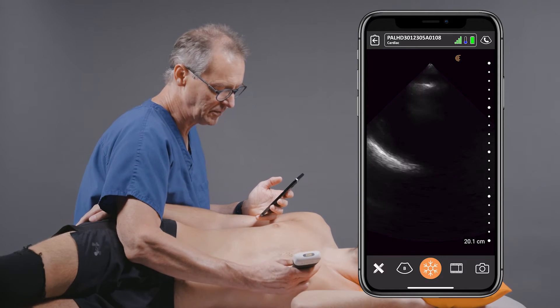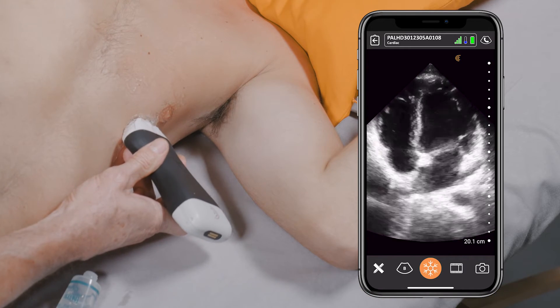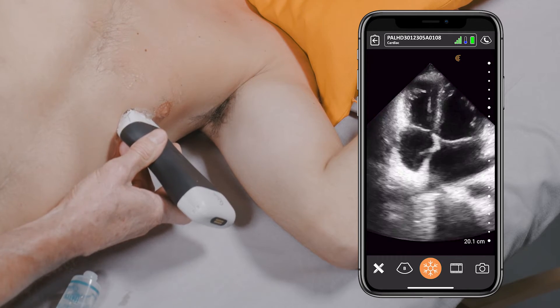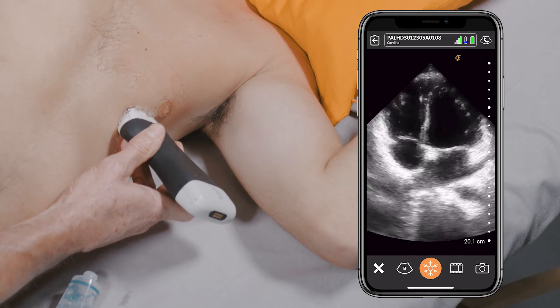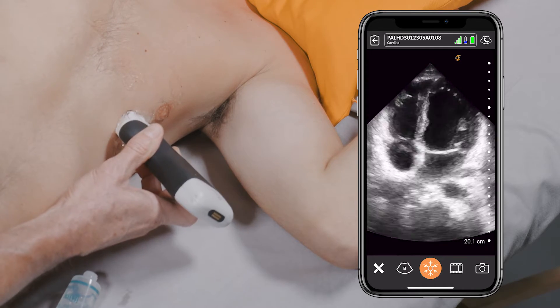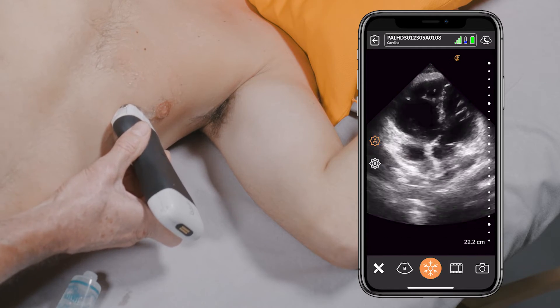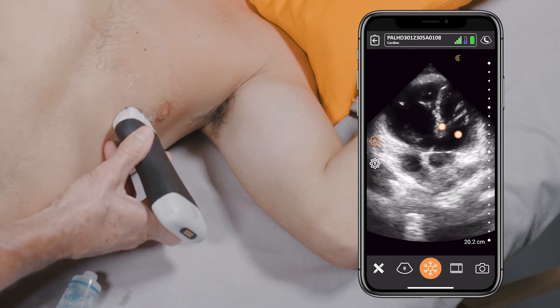The next view is the apical four chamber view. Once again, the image quality is fantastic. You get a beautiful view of both the right and left ventricle — a great way to assess for left ventricular and right ventricular function. You also get nice views of both atrioventricular valves. We can angle the transducer a bit to get into the apical five chamber view, where we get a beautiful view of the aortic valve and the aortic outflow tract.